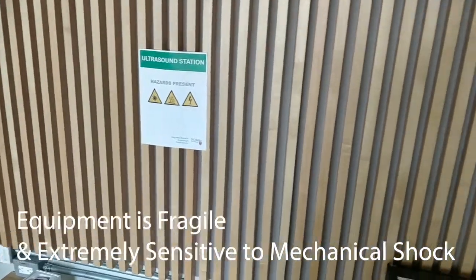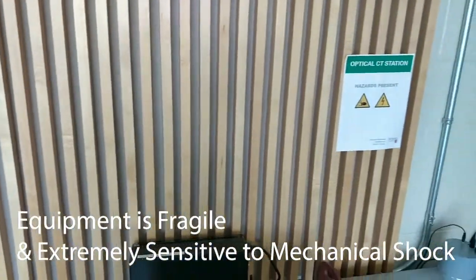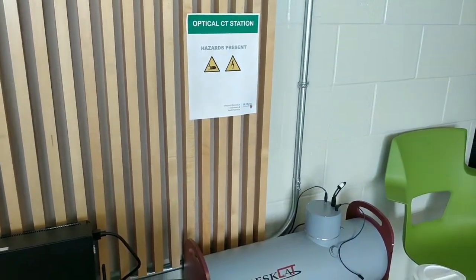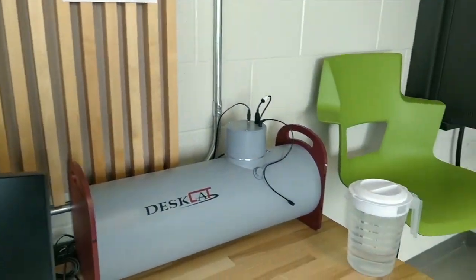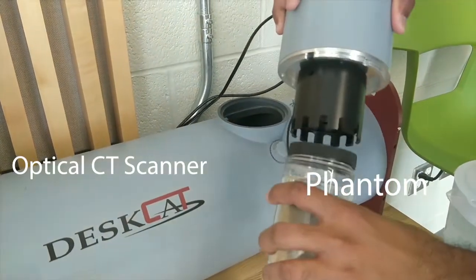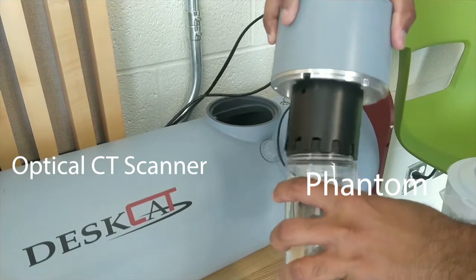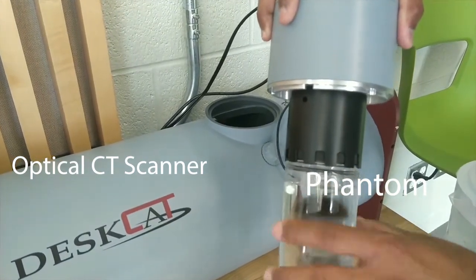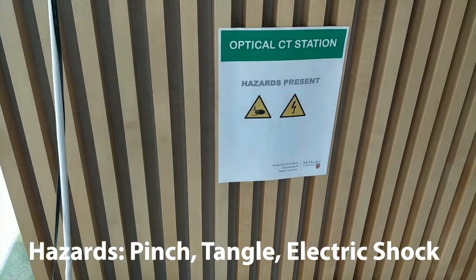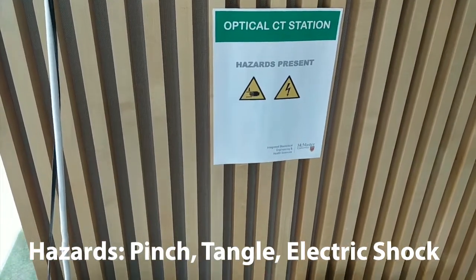The equipment in this lab is fragile and extremely sensitive to mechanical shock. Therefore, please handle with care. If the equipment is used improperly or for non-intended purposes, serious to fatal injuries may occur. In the medical imaging lab, you will have the chance to work with the optical CT scanner and phantom. When using the CT scanner, please be aware of pinch, tangle, and electric shock hazards.